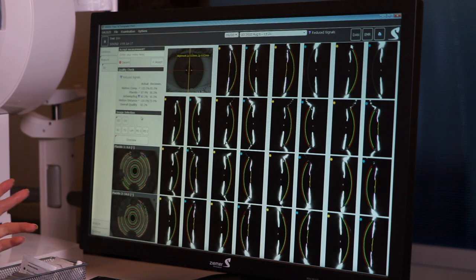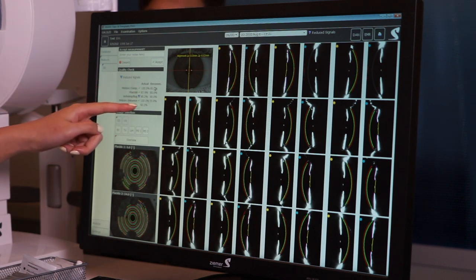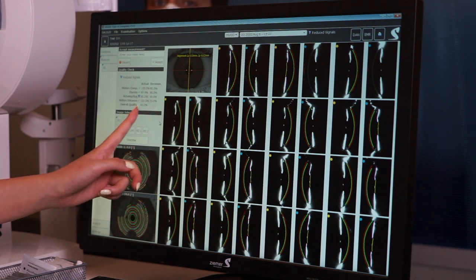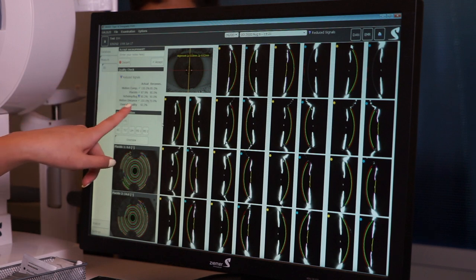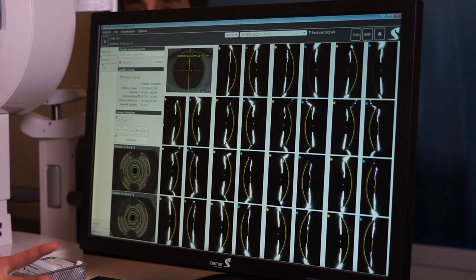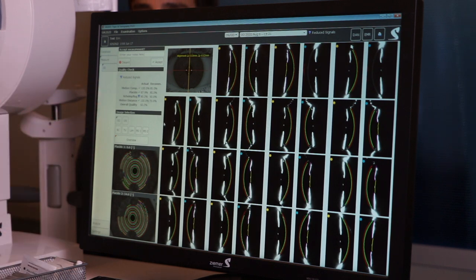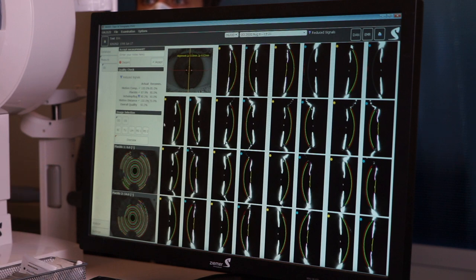After you take the image, a results screen will show up. There are a couple of things to look for before you hit Accept. You want all of the indicators to be green check marks — this is the recommended percentage and this is the actual. If you get a reduced signal, 85.2 percent is pretty close to 90 percent and may be okay. But if it says reduced signal due to lashes or lids in the way, retake the image. Ideally, you want all green check marks.